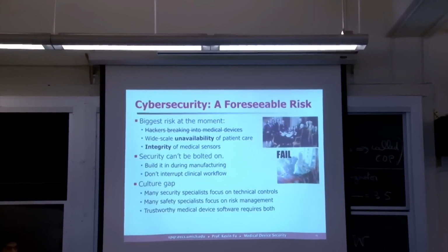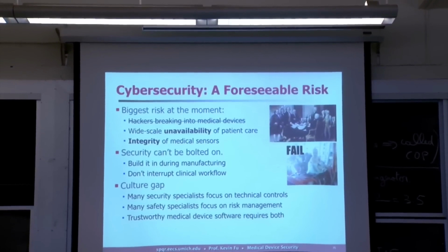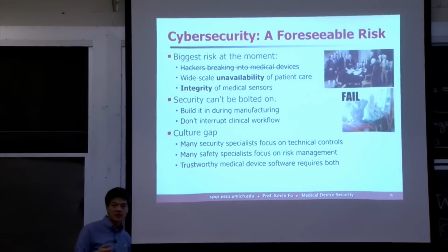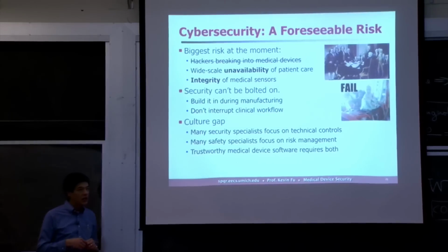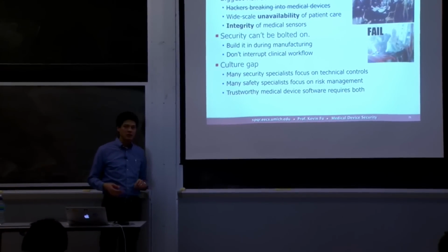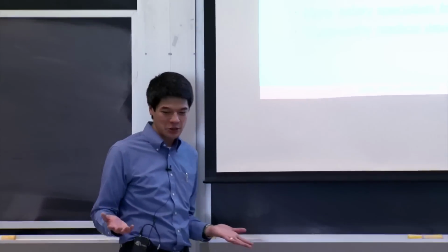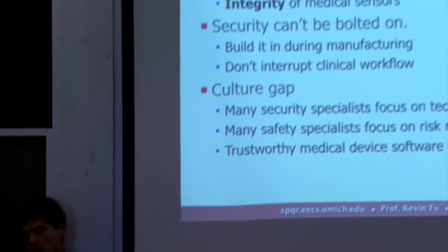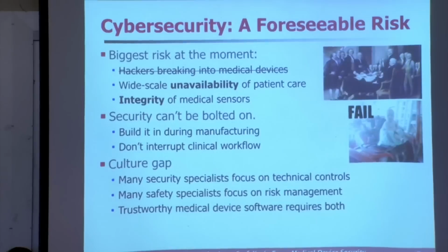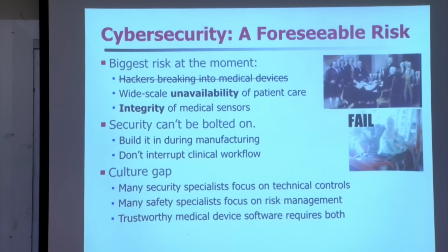In risk management, you look at risks and benefits, and you ask yourself, do they balance? If I take an action, does that improve my risk management outlook? So if you're going to decide, for instance, am I going to deploy a password system on all of my medical devices? A security person might say, duh, of course you're going to deploy passwords because you need to authenticate. The safety person might say, well, wait a minute. If I require we have passwords on every system, we're going to have to worry about sterilization. How do we know how often to time out? Oh, and what about emergency access? What if we forget the password? We want to make sure we can get a response time in 30 seconds. So they might actually make a different decision.